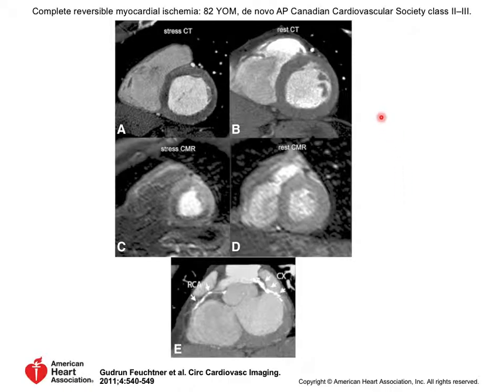So we can look at T1 weighted imaging with CMR for trying to image relative perfusion of myocardium. And this is very similar to SPECT in the sense that we're injecting a contrast agent. That contrast agent is going to go to different compartments, say the heart, and then if there is high perfusion in the heart, you will see the signal will get brighter because the T1 gets shorter as the contrast agent goes in.